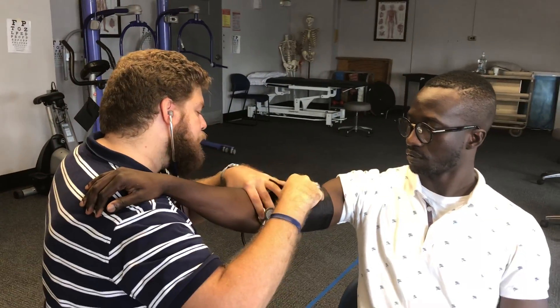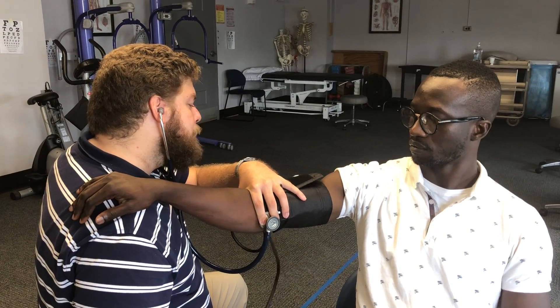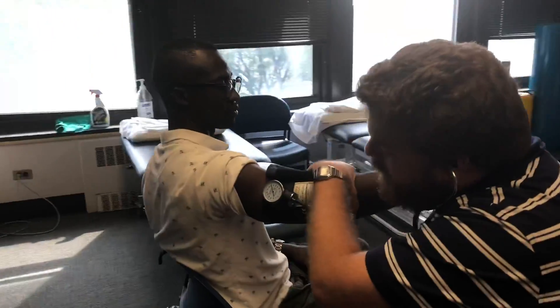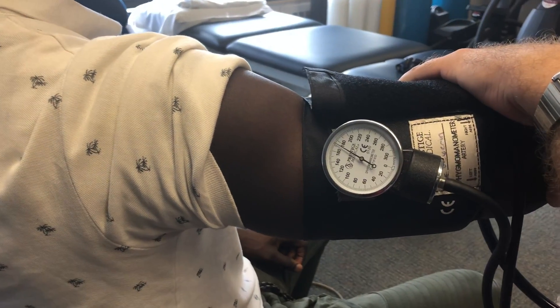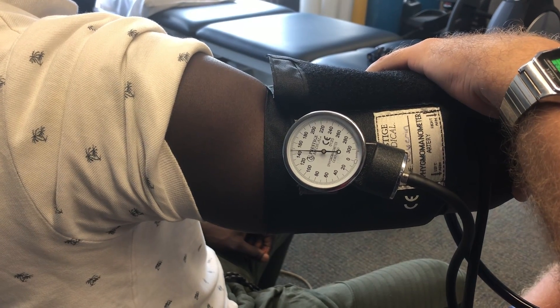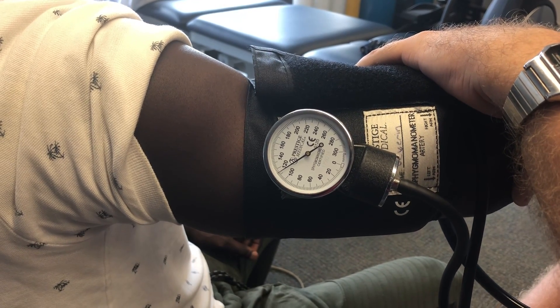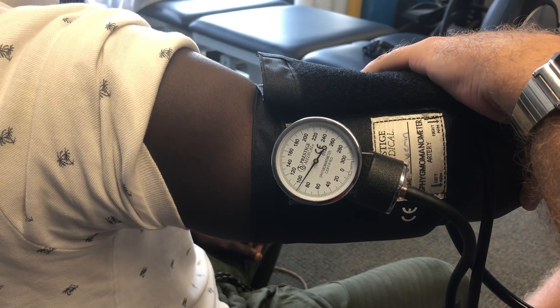When we inflate, we'll talk about ways to prevent an auscultatory gap, but for most people you can probably just inflate to 180 or 200. Then we'll slowly deflate. The deflation speed is key — we want this to be about two millimeters of mercury per second, nice and slow. If we go too quickly, we're not going to get an accurate measurement. And we're listening for that first sound, which is going to indicate the systolic blood pressure. Don't go by the needle movement — go by what you hear.